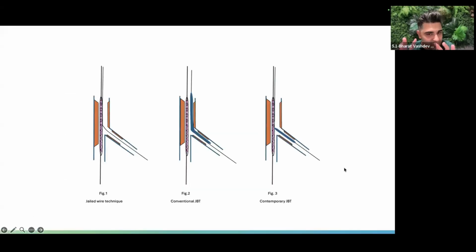And this next figure shows it. And then you inflate the stent with the balloon there, remove the balloon if you don't have side branch compromise, and then do your POT and post-dilatation as you would normally. So you're basically increasing the profile across the side branch. In addition to the wire, you have an uninflated balloon.